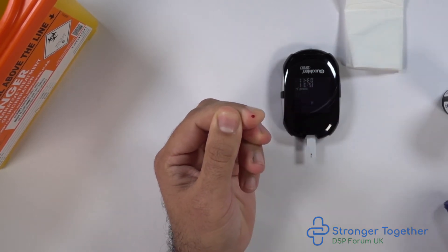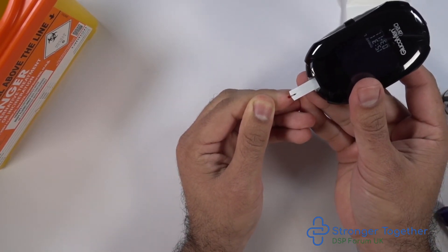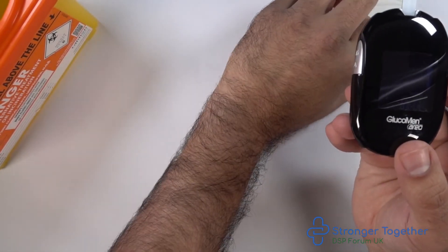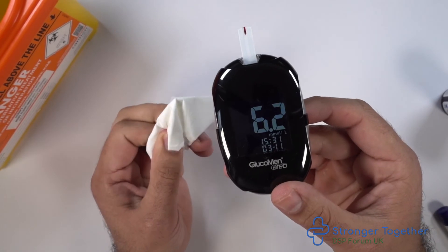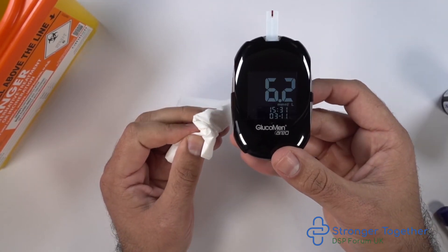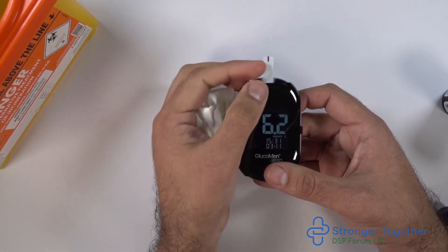We then squeeze out the blood drop. We then place the meter with the strip against the finger where the blood drop is located. As you can see, the test strip draws up the blood automatically and we have a countdown from five to one. We now have our reading shown on the screen. Take your tissue and hold this between your finger you drew the blood from and your thumb. And if you drew the blood from your thumb, hold the tissue between your thumb and your forefinger.